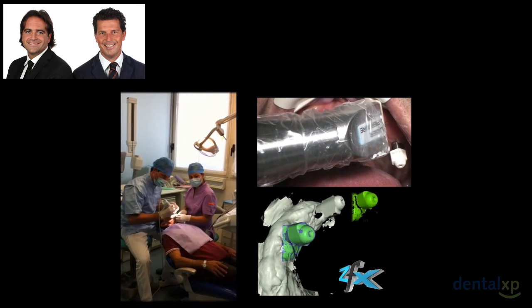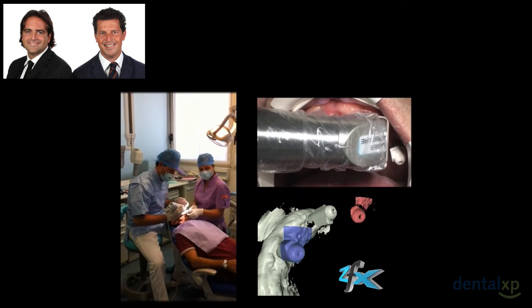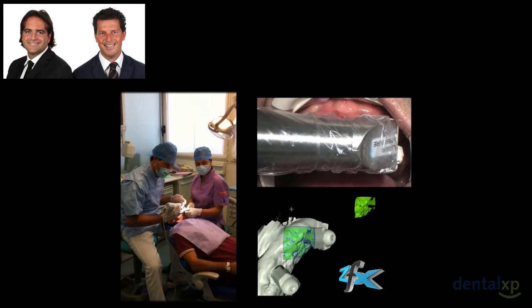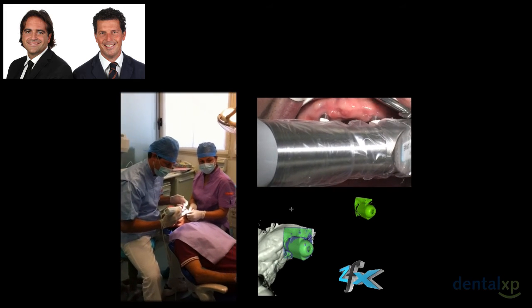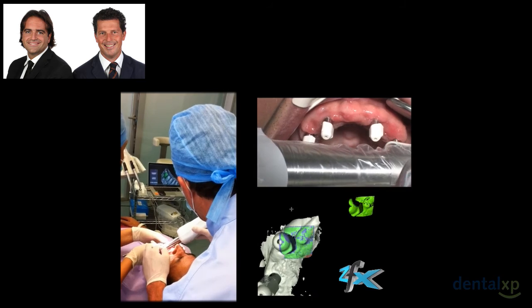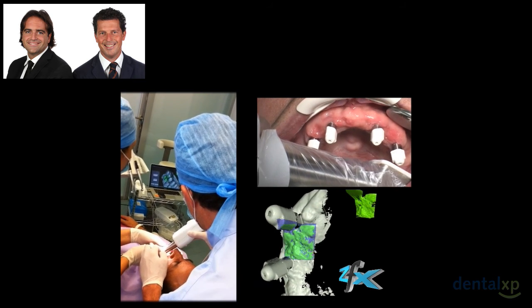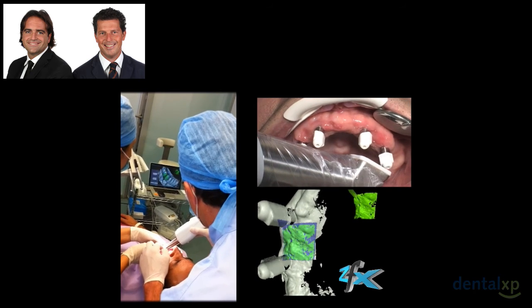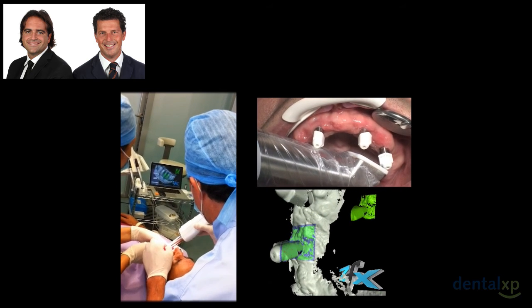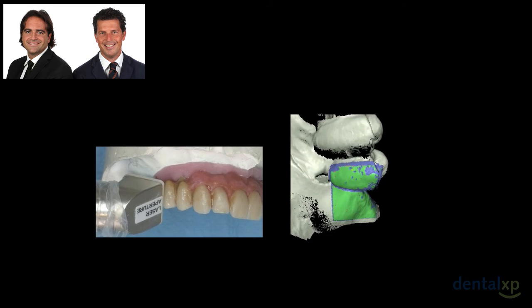We are still working on it. We think that right now it is still too early to go completely digital for this kind of patient, but this slide is very nice because it gives you the whole digital workflow when we are taking the digital impression. You can see that Alessandro is looking at the screen. You can see how slowly the clinical movements are, and what is displayed on the software.